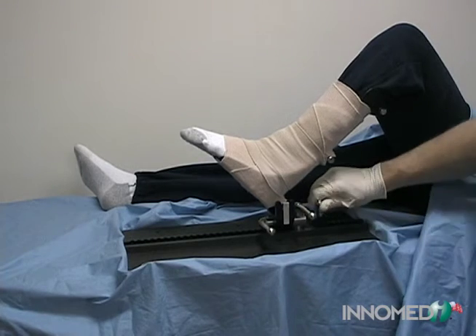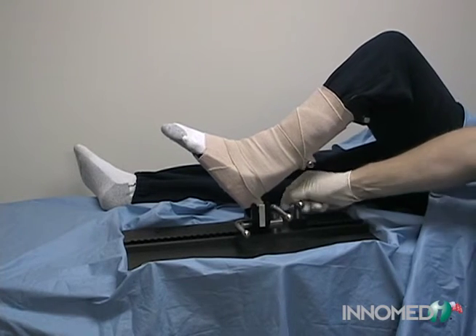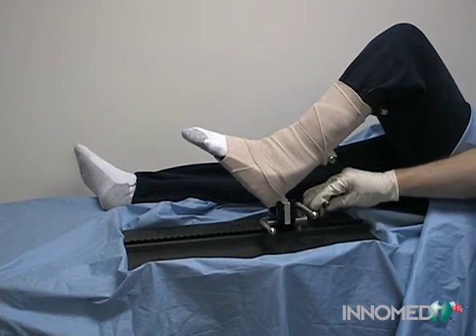The ratchet allows the yoke assembly to be moved up or down the track in a gradual manner, or downward pressure can be applied for quick adjustments.